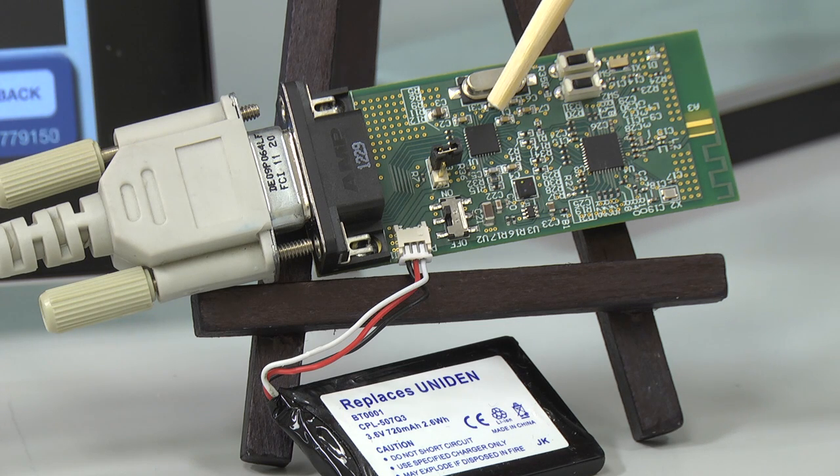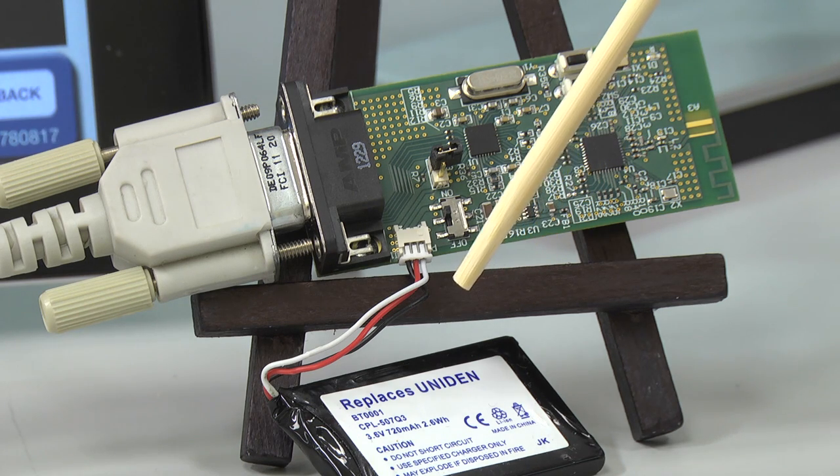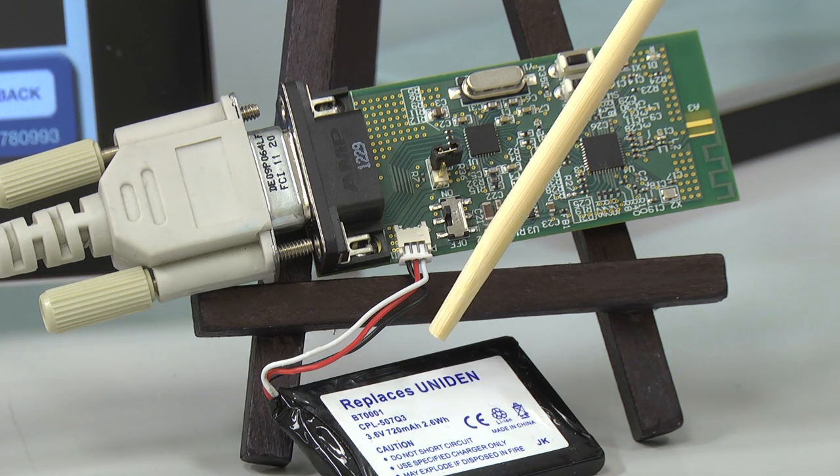On the demo board is the ADS1293 device, which is this ECG AFE. The ADS1293 is capturing the heartbeat signal and digitizing it, and this data is transferred wirelessly using this Bluetooth CC2541 device. On the very bottom you see here is a lithium-ion battery, which is powering the board.